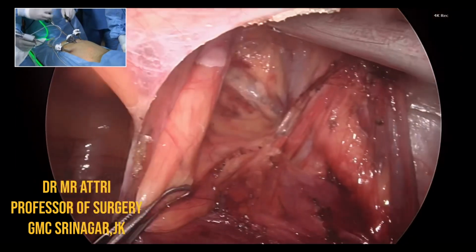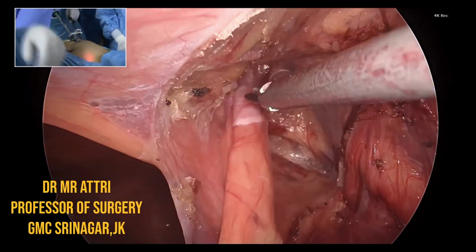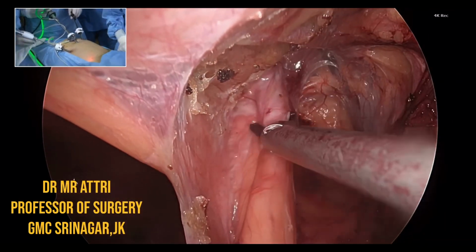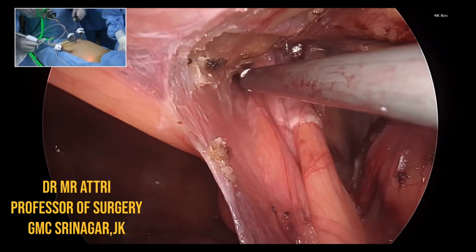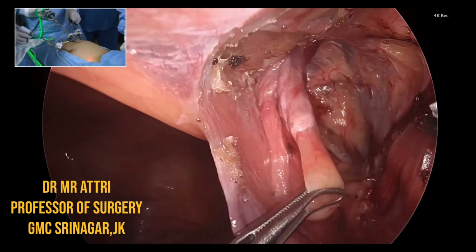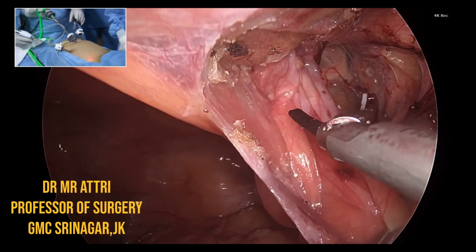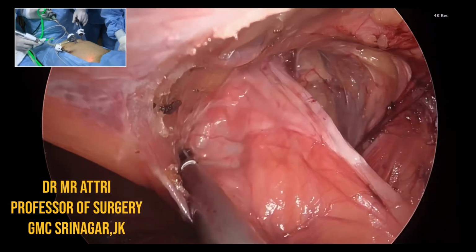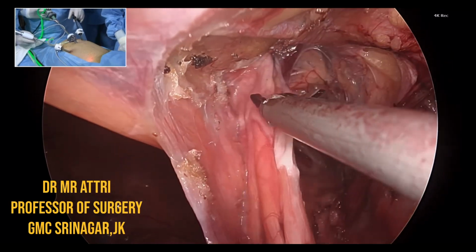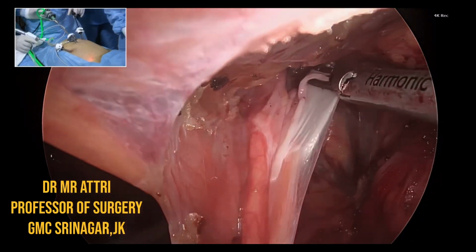Can I just interrupt one thing? Yeah. So in this patient you don't need to cut PRS because you can do it right-sided. If the defect is more than 6 centimeters from the linea alba, you don't have to cross over. You can do the right-sided retrograde. All we need to do is TAR. And I think doing a TAR in this patient is going to be handy in getting a tension-free closure. That will be a component separation on that side, which will help because this is the bony area and will be very tough tissue, and the defect may look very small but it will be very tough. So I think TAR will help us in closing the defect. We will not cross the midline because if it is beyond 6 centimeters, we can do the space.